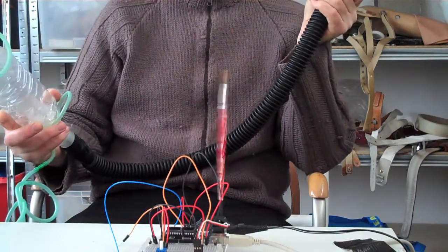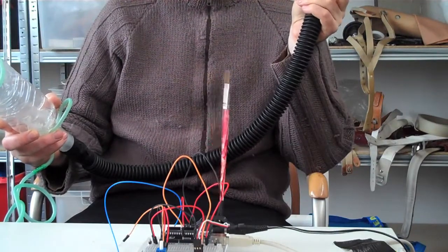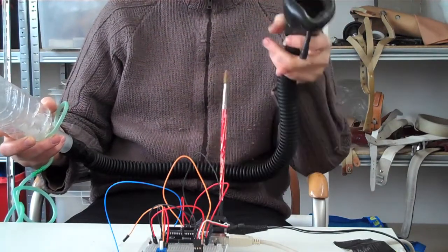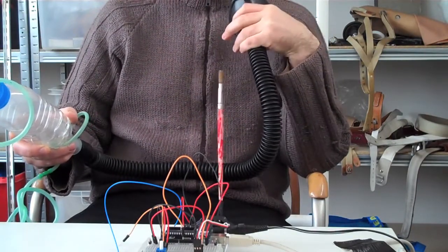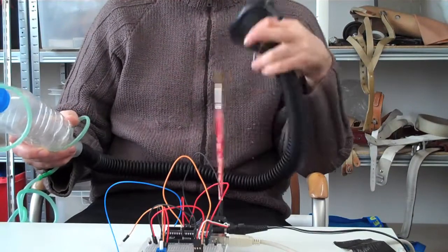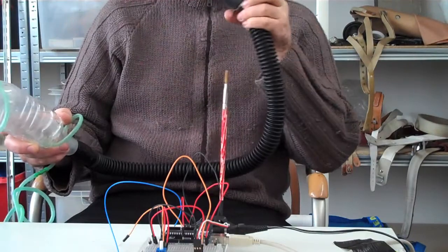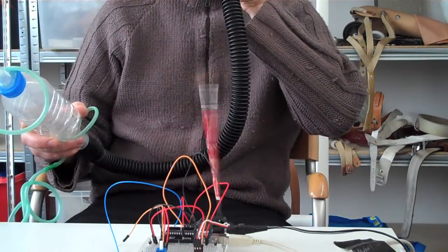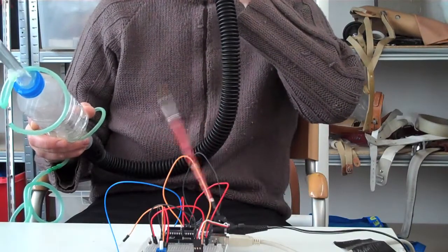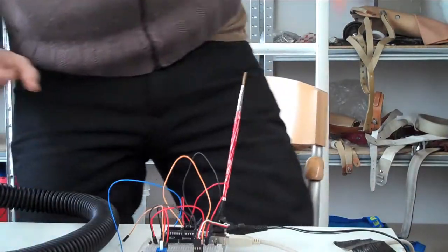I have to say it feels incredibly responsive. It's absolutely real-time response on this particular servo that I'm getting with my breathing. The correlation between what I can feel my lungs doing and what I see this brush doing absolutely correlates. It's just a bit twitchy.